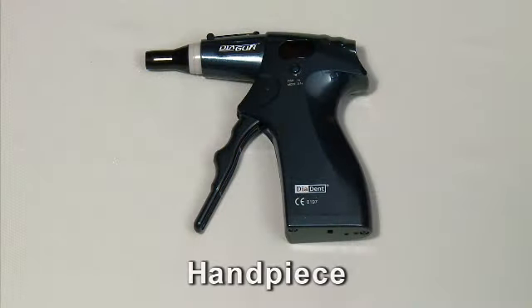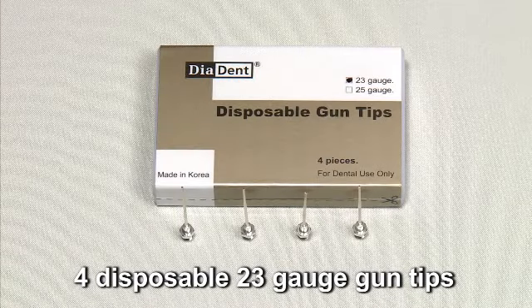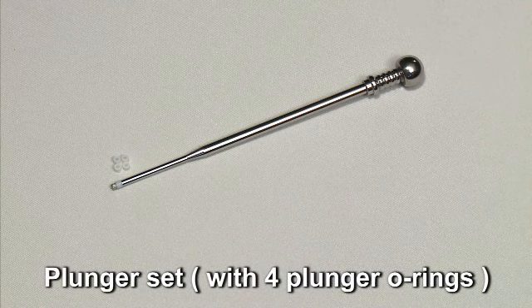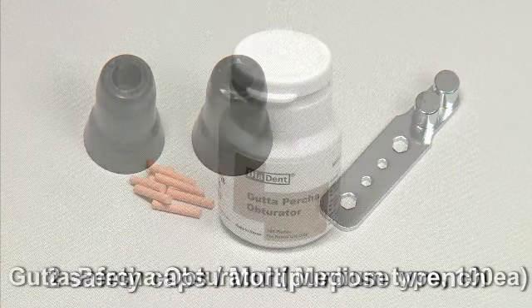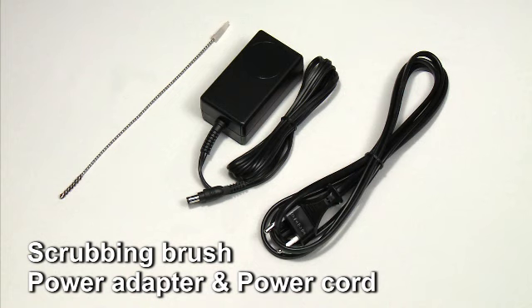The Diagun kit includes a handpiece, a charger base, four disposable 23-gauge gun tips, a plunger set with four plunger O-rings, two safety caps, a multi-purpose wrench, a bottle of Gutta Percha obturators, a scrubbing brush, a power adapter, and a power cord.